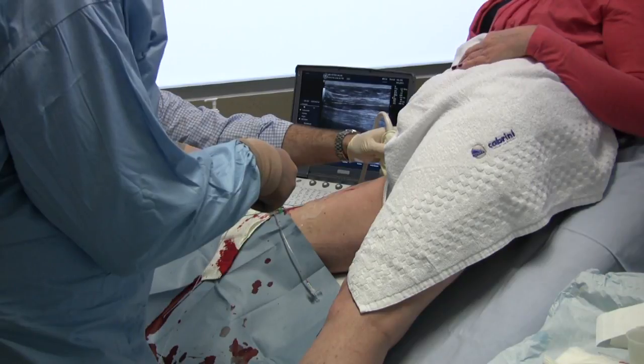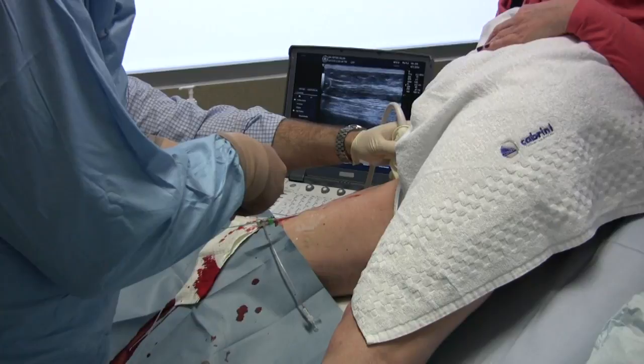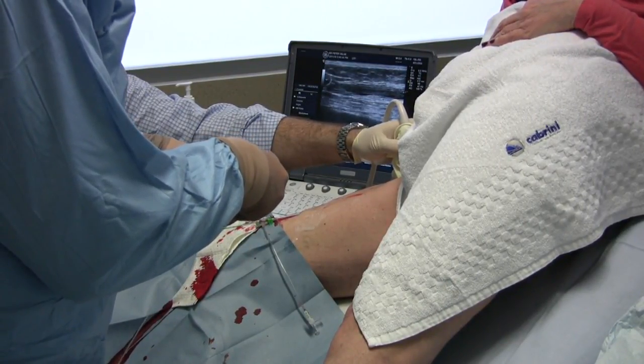This is tracked down the vein with ultrasound so that the correct amount of power is delivered to each segment of the vein, and this caters for veins of varying diameter.